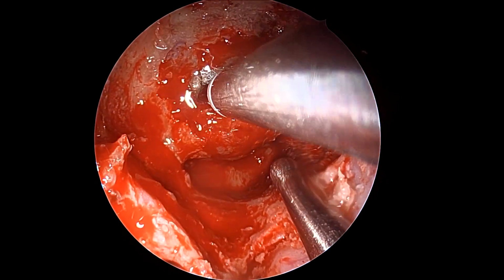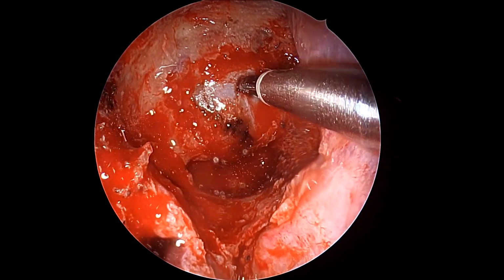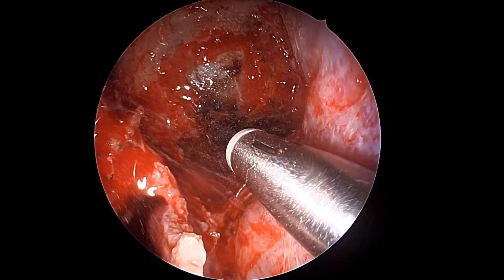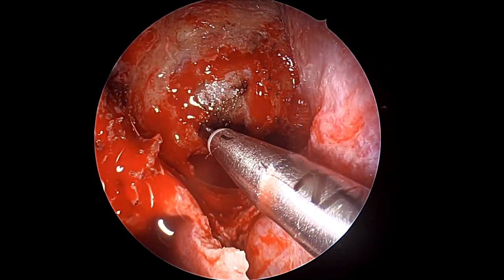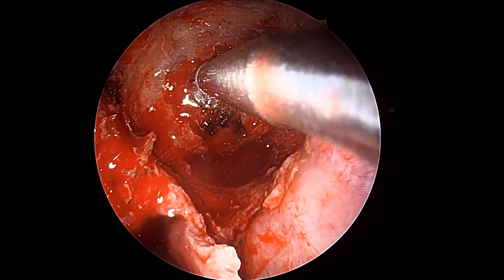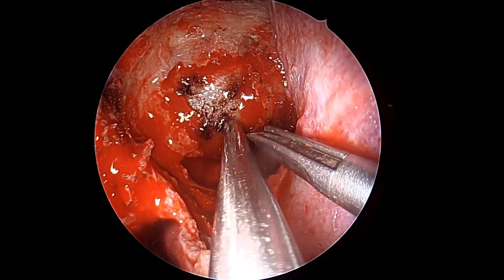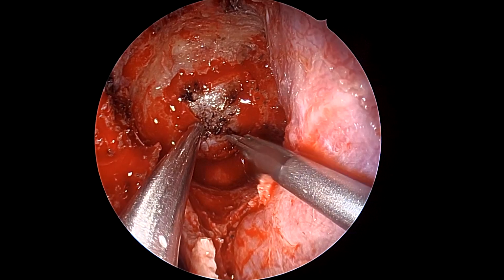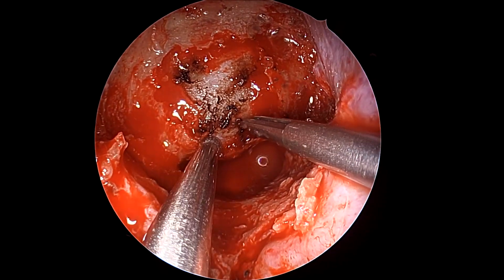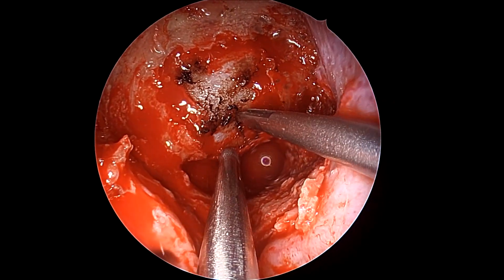Once we have exposed a fair amount of the periosteum of the Sellar, just use some bipolar brush strokes to coagulate any surface vessels that would be lurking inside to avoid any bleeding. And then you would start by giving an incision, standard cruciate incision in the central part of the dura of the Sellar. Now, the incision could be anything. Some people like to use a U-shaped inverted or a standard U-shaped flap. Some people don't like a cruciate incision. It's rather variable, and I think it's more or less surgeon dependent without any specific issues with any one incision.